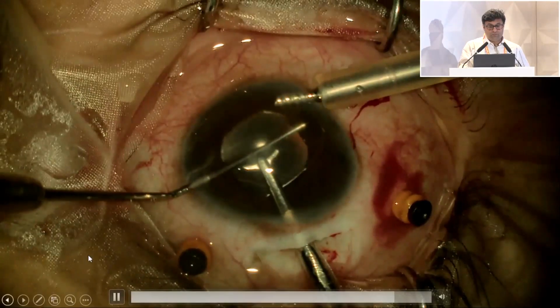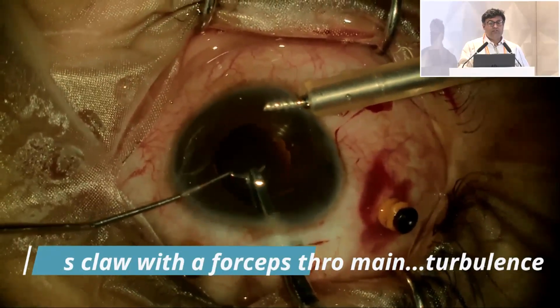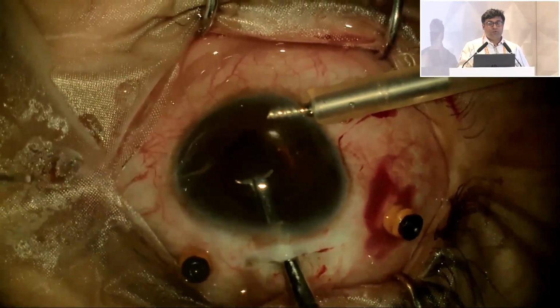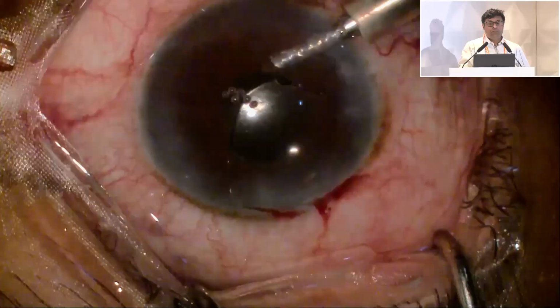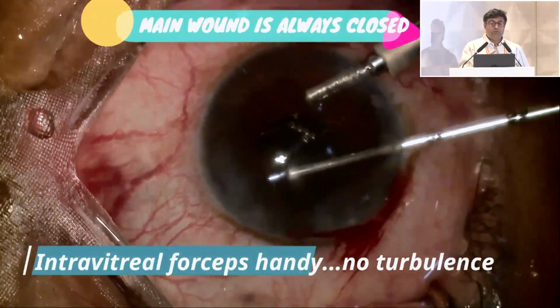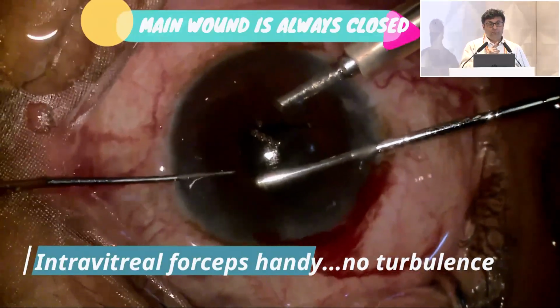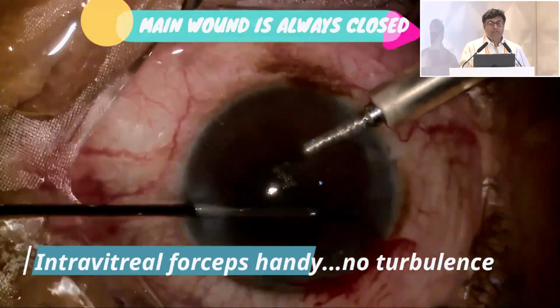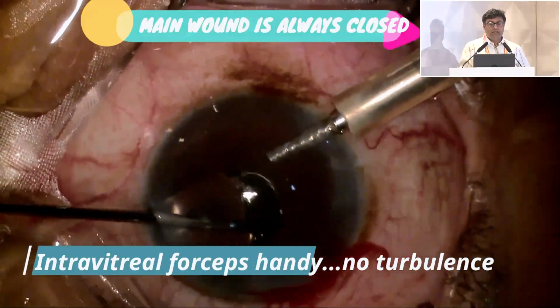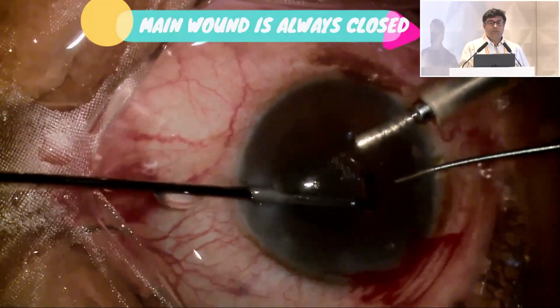And this is the final stage where I put an iris claw lens. Now this is the usual way of implanting an iris claw, but you see the amount of turbulence it creates because there is an open wound and you're going through the main wound. Now this is again an alternative maneuver where you go through the side port with an intravitreal forceps and enclavate one haptic into the iris, and then you go from the other side port with the same intravitreal forceps and enclavate the other haptic.